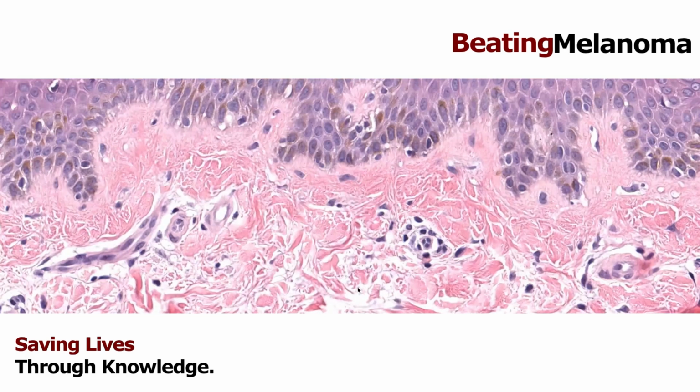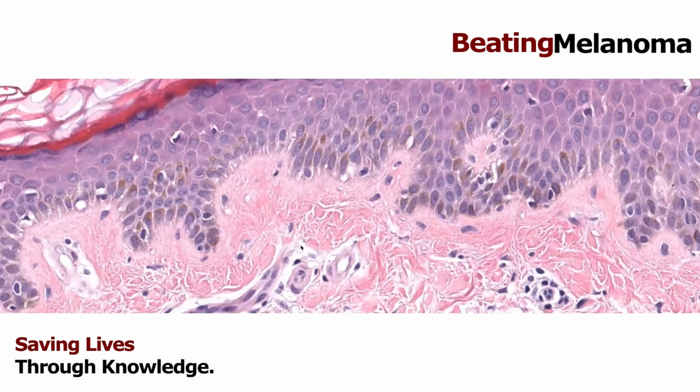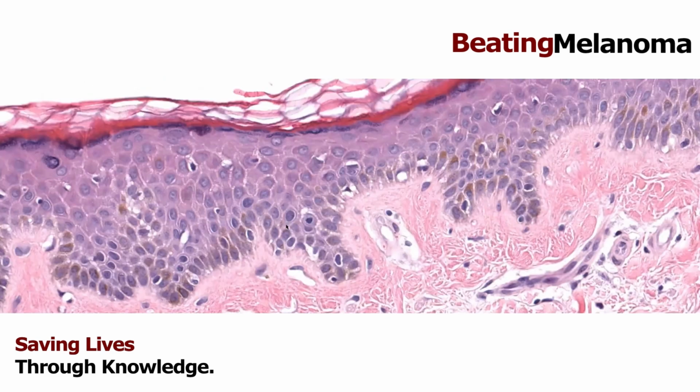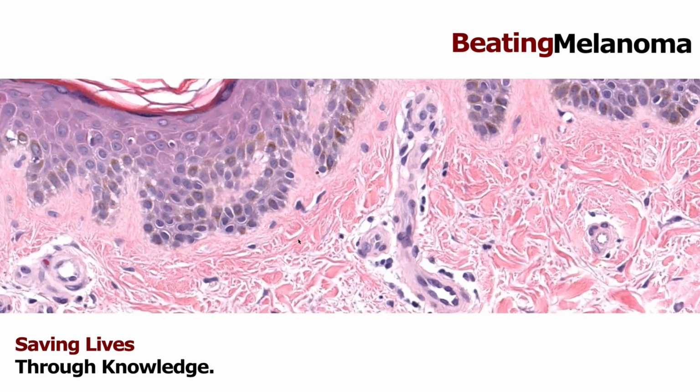Can you show us the melanocytes again? I think the one important thing is this is a normal melanocyte. If you have melanoma, that is this type of cell. Yeah, exactly. Yep. It's this little dark guy right here. Unfortunately, I can't zoom any further in on this, but that's the little dark round cell that doesn't look very special or specific at all.